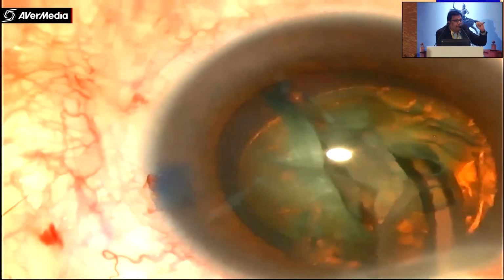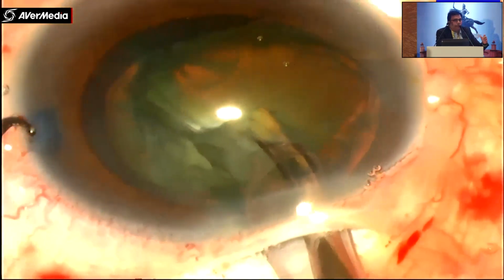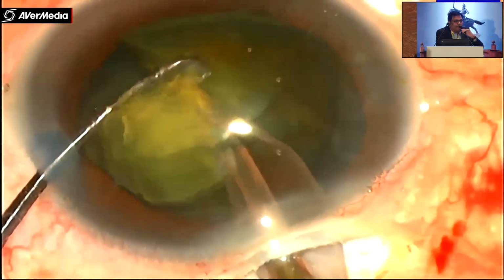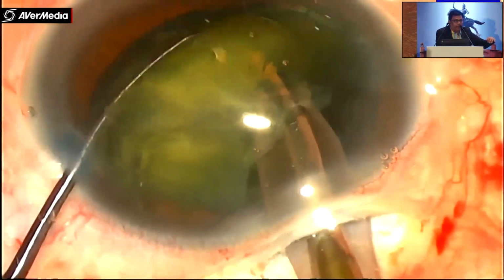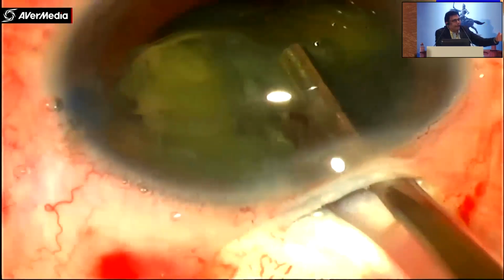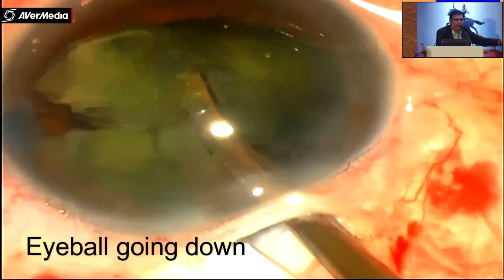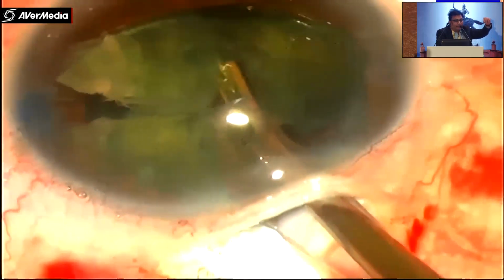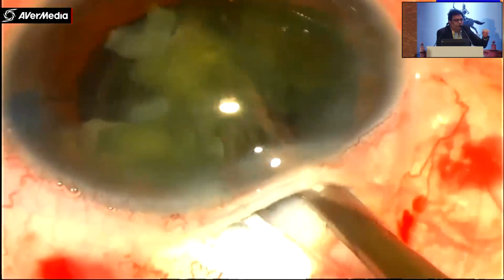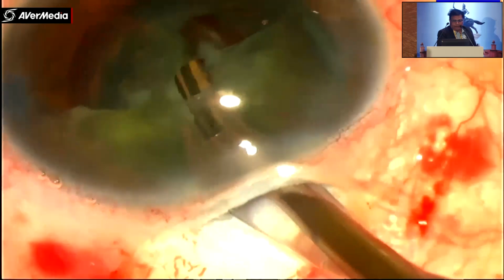This is very, very important, because when you try to remove the pieces and the position is not correct, you unnecessarily blame the machine. New people may increase vacuum and flow rate, or say, "Today phaco is not going well, today the tubing is not good." I would have used the new tubing. But the point is that it's your primary position which is responsible for fantastic phaco fluidics, phacodynamics and water current.